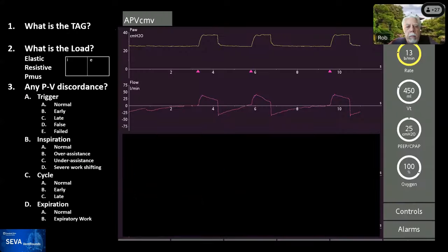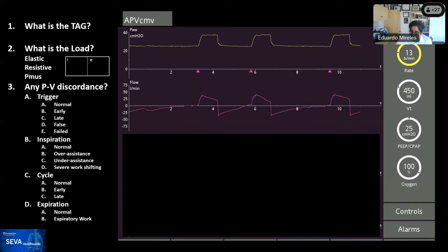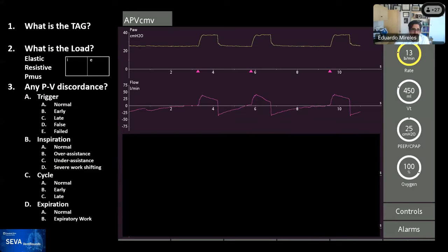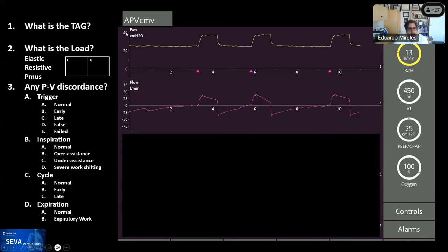Here we go — next slide. This is the mode, and this has been enhanced. This is a Hamilton C6; the screen looks a little brighter, but that's needed so you can see the waveforms better. As always, we start with the TAG. Challenge yourself and put in the chat what you think is the TAG for this ventilator mode — you can see it up on top. I'll give you a couple of seconds to take a look.